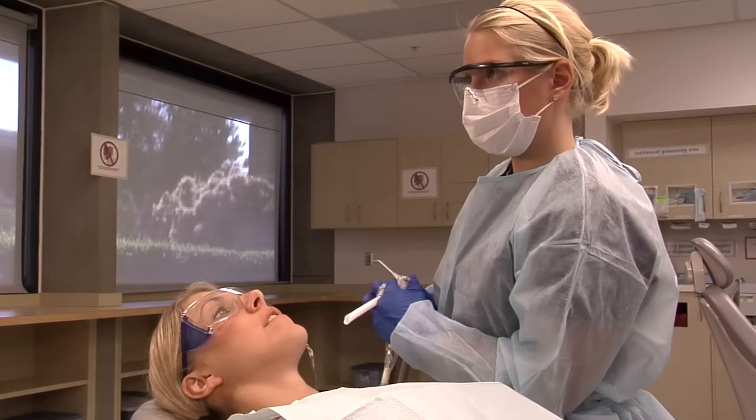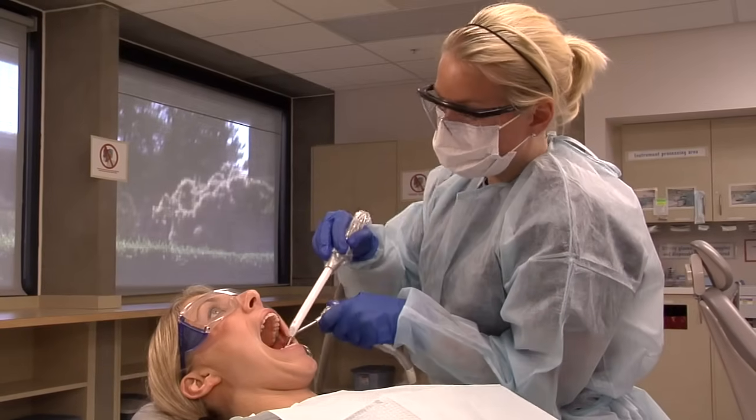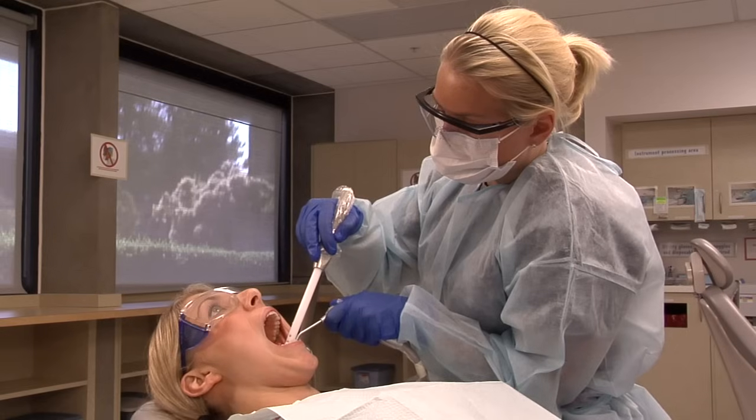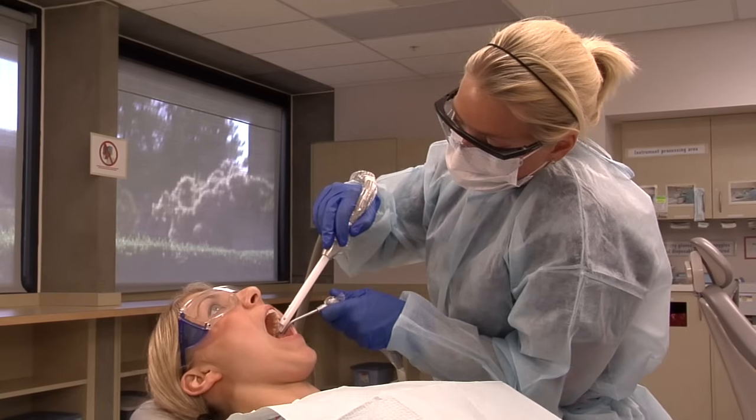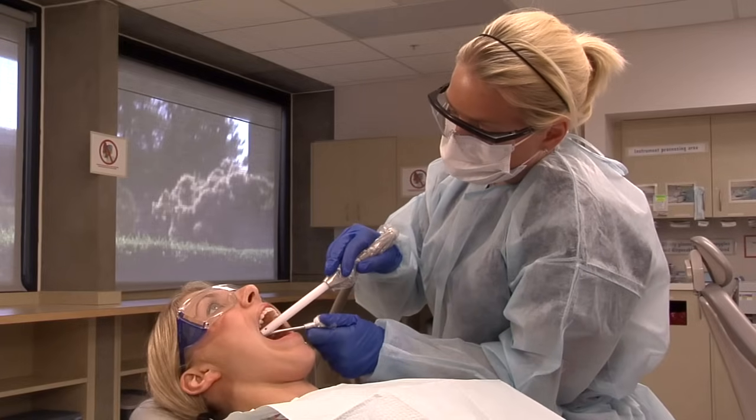Suctioning is an important dental assisting skill that takes a lot of practice. Do not be discouraged if this procedure seems difficult and frustrating at first. With practice, you will become proficient in this skill.